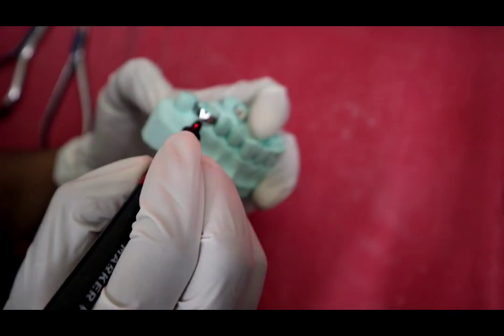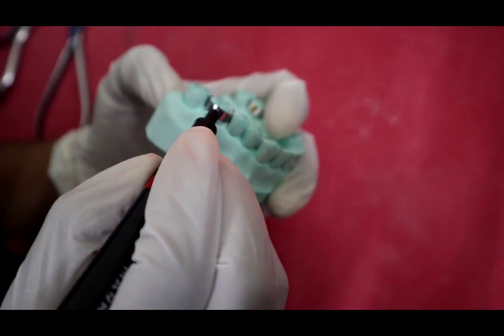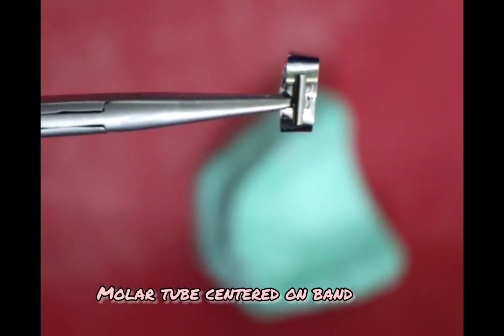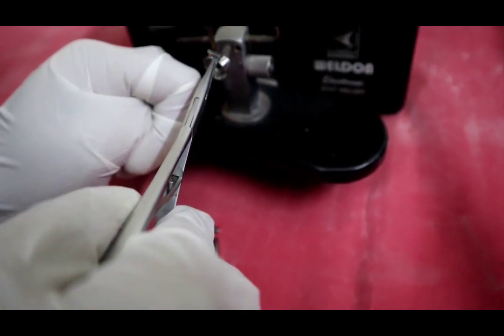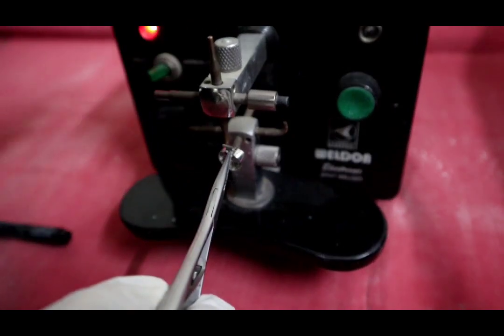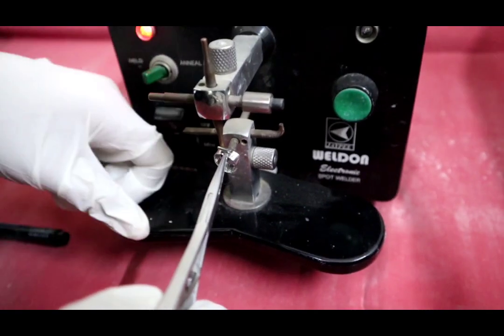To weld a molar tube on a band, first mark the buccal groove on the band, then center the molar tube symmetrically on either side of the groove marked on the band. Then place this carefully between the electrodes and activate the welder to make a tack weld.